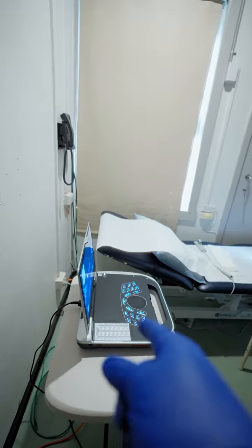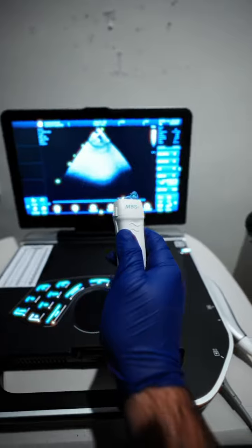Today we're using the Vivid IQ, a portable ultrasound system, which is perfectly great for this kind of mobile work that we do. These are the parasternal long axis images from the first patient, and I'm measuring our end diastole and end systole to obtain our Teichholz ejection fraction. Then I measured my aortic root at the start of the QRS and my LVOT measurement at mid-systole.